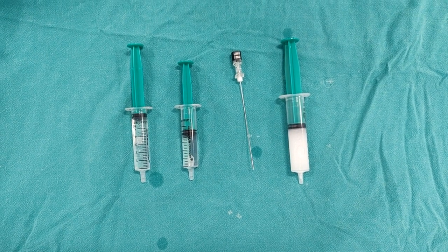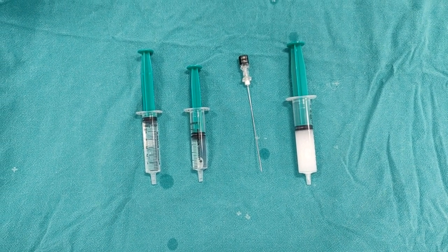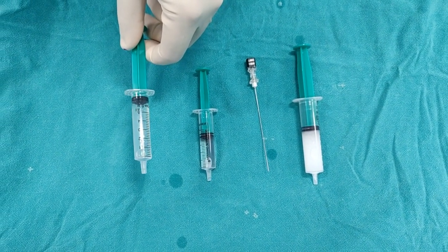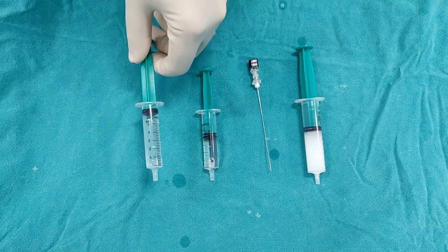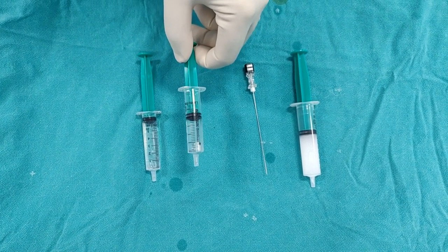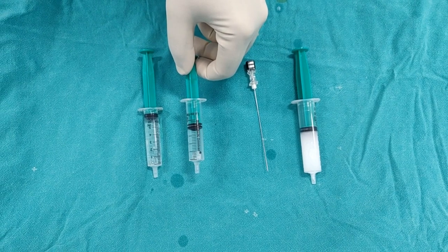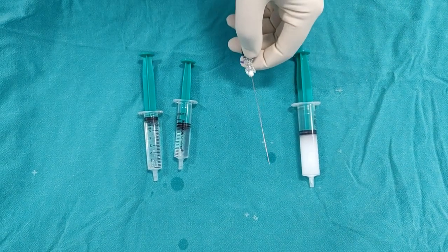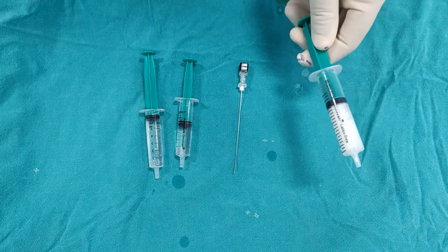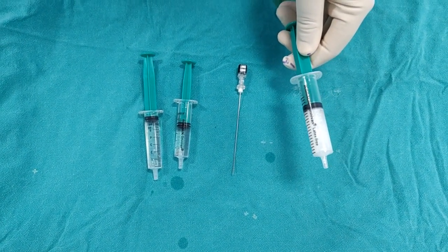Today we are going to use a lateral approach to inject. This is our local anesthetic that I will use to anesthetize the track. This is the Omnipaque that will be used to confirm the location of the needle — whether it is in the joint. And this is a spinal needle, around 21-22 gauge. And this is the steroid mixed with some local anesthetic that will go into the joint.